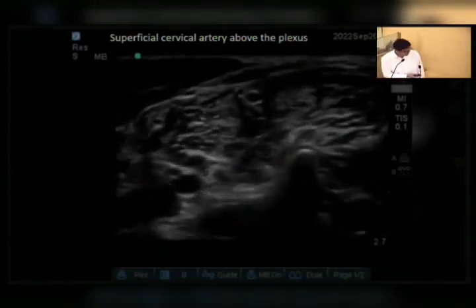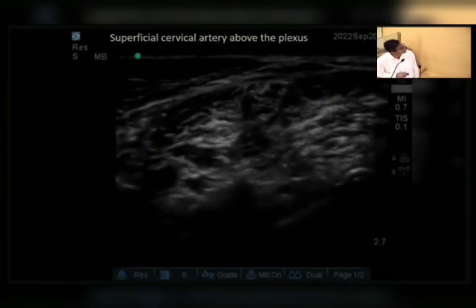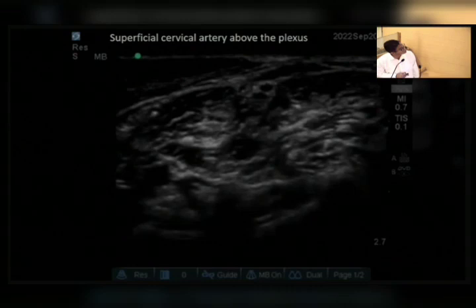Second thing, you will find the superficial cervical artery just on top of the plexus, just below the superficial cervical plexus, somewhere over here. Here is the transverse cervical artery. So vessels are normally there, you have to avoid them.